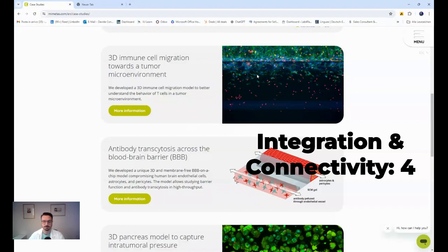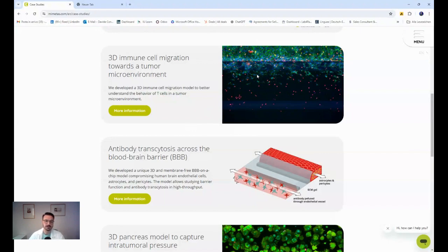In terms of measurement and monitoring, here we are falling back to what most of the others are doing. A lot of the monitoring is done through sampling. In this particular case, you would not have a recirculation of the media outside the chamber. It's everything done inside.